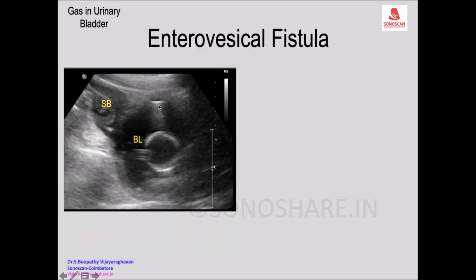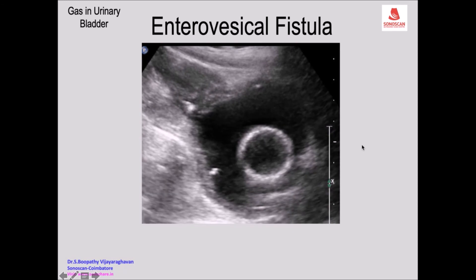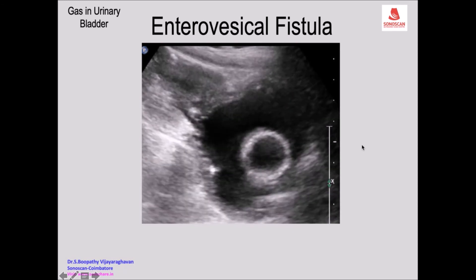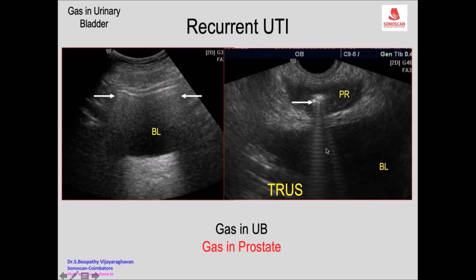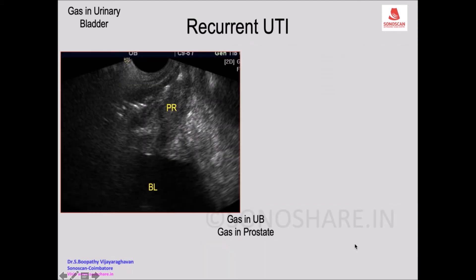Gas is seen in the urinary bladder and there is a Foley bulb in the bladder. You see a thick-walled small bowel loop adjacent to it, and there is a fistulous tract confirming that it is an enterovesical fistula. Gas is also seen in the prostate with reverberation artifact and dirty shadow, and when you turn to longitudinal scan you see the prostate - actually the gas is in the prostatic urethra.